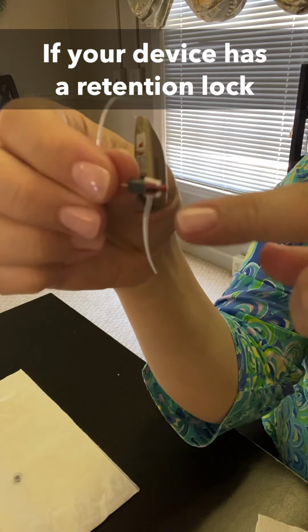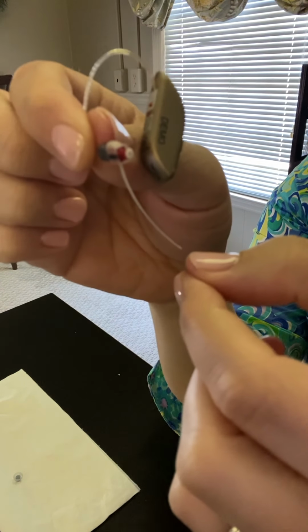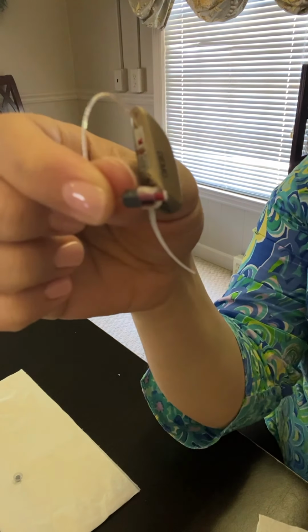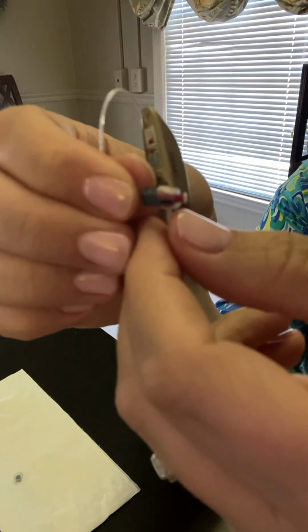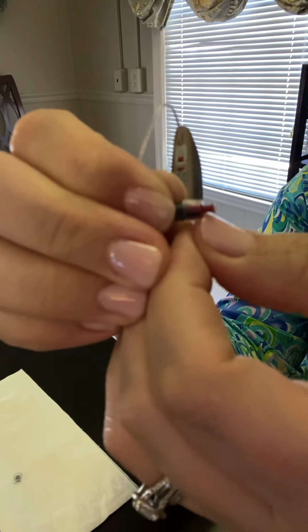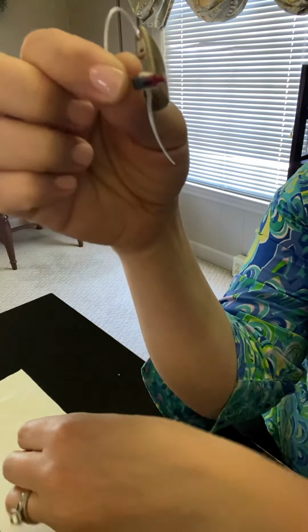Replacing the filter with a retention lock is a little different. So this is a retention lock. You might have heard it called a kickstand. It helps keep the device secure in your ear so it doesn't try to walk out when you're talking or eating. So this one's not on quite far enough. We want to slide it on all the way, just like that.